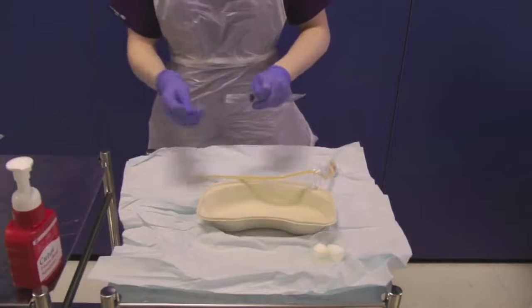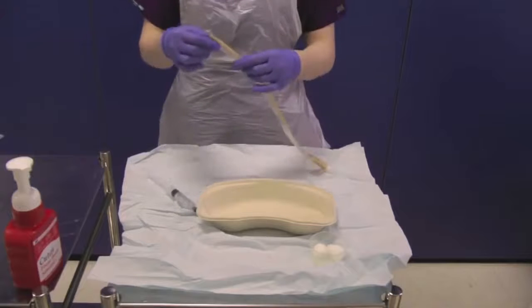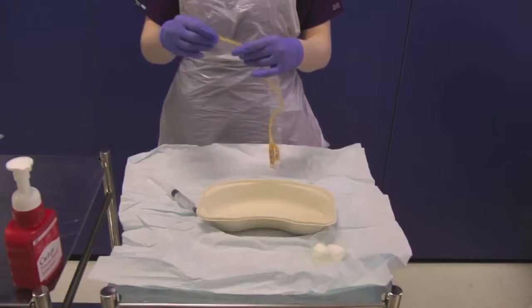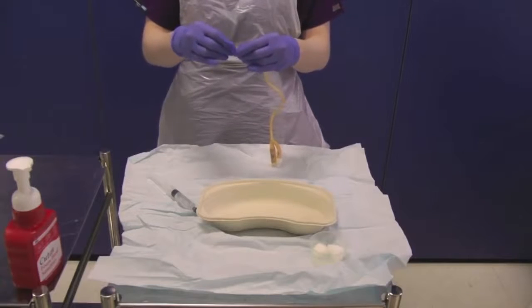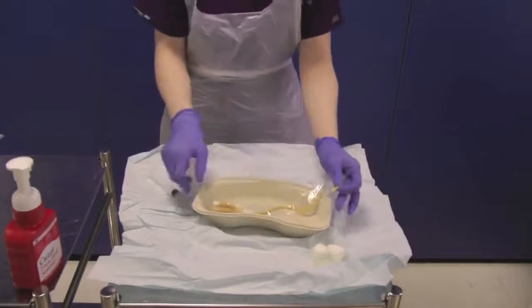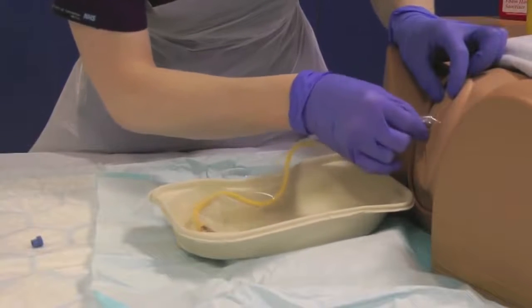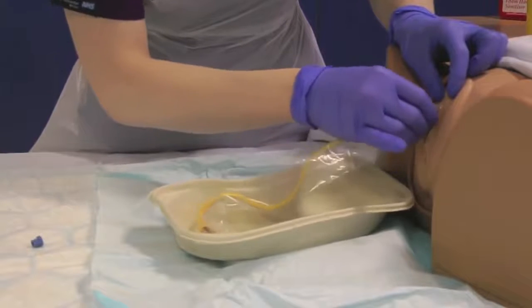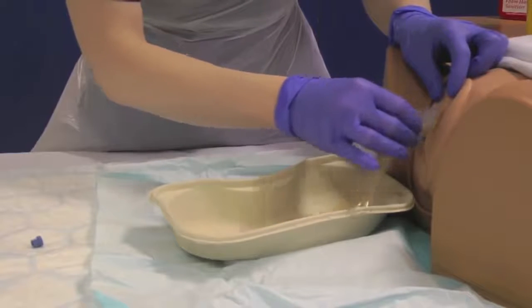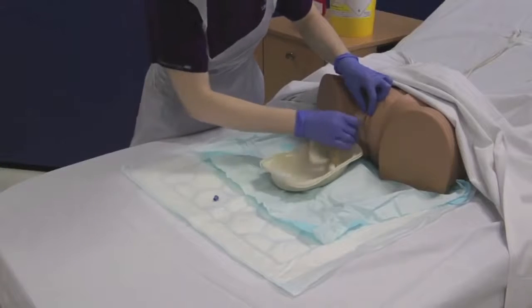Open the 10ml syringe from its sterile packaging and leave this on your sterile field. Open the urinary catheter from its sterile packaging using the perforations to help you, exposing the catheter tip only. Hold this in the sterile J tray and place onto the bed between the patient's legs. Avoid touching the catheter directly, using the packaging as a barrier. You may need to part the labia at this point. Insert the catheter along the urethra into the bladder. If there is any resistance, ask the patient to cough, which may ease insertion. Never force the catheter. Once the urine starts to flow, advance the catheter a further 5cm.